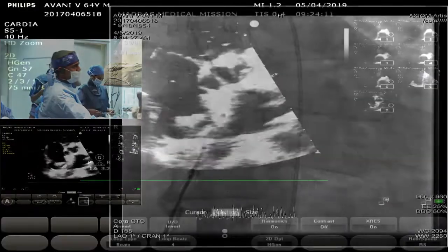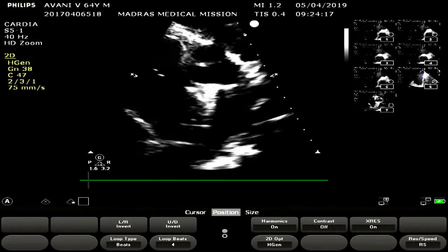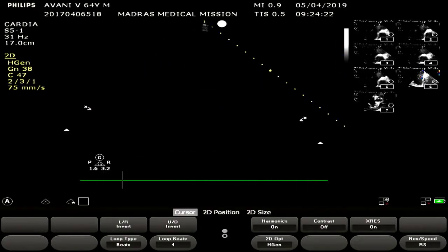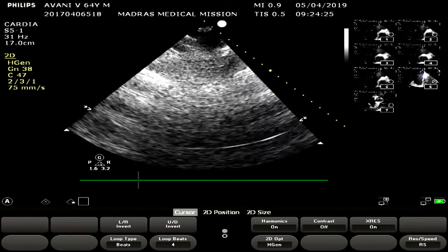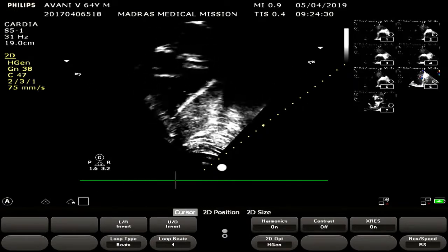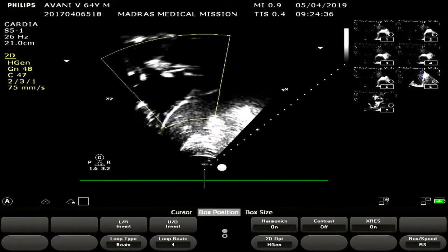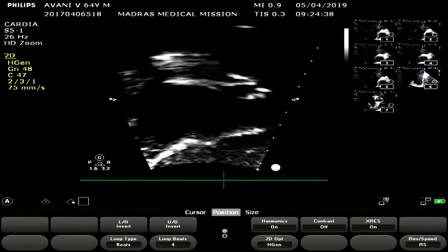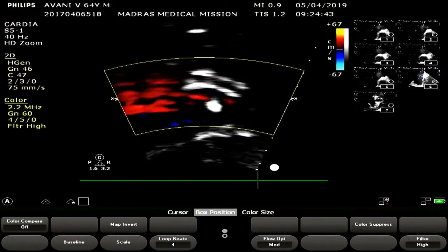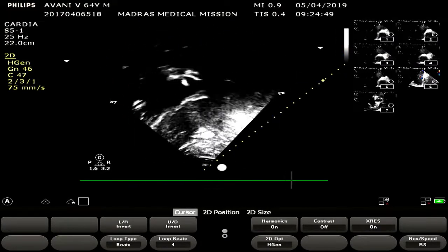So in that scenario, do you have to upsize your device after deploying one, or do you get much embolization, or do you hardly ever see that kind of thing? Yeah, actually we do quite a lot of ASDs here. Our volumes are maybe 150 to 200 in a year, and in India many of the operators just go by a non-balloon sizing approach. We do a reasonably large number. We try to make this particular procedure reasonably simple.